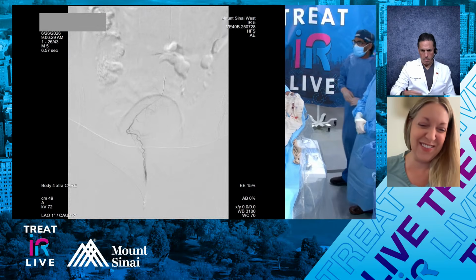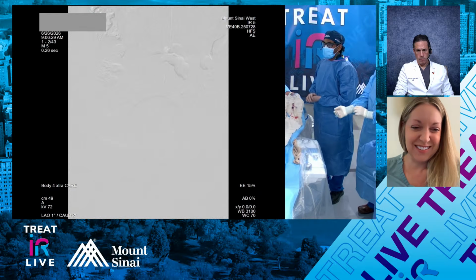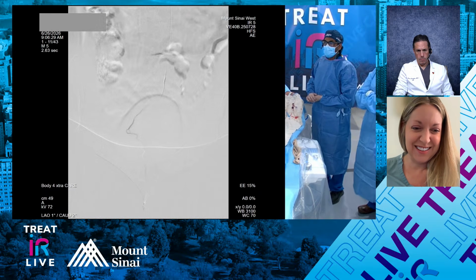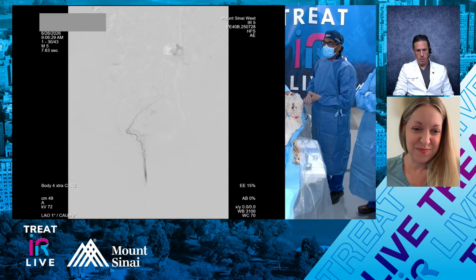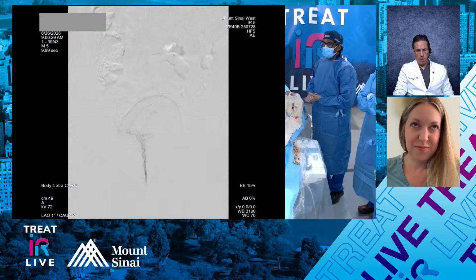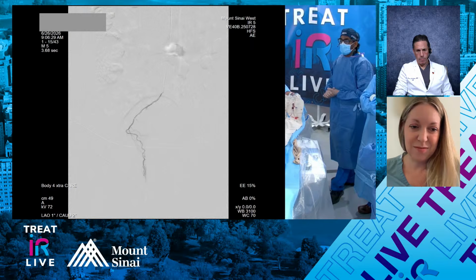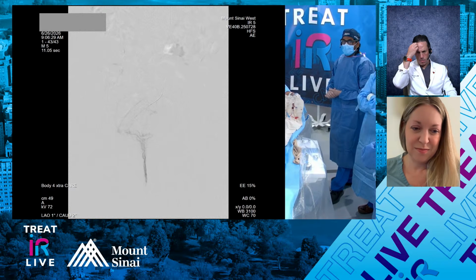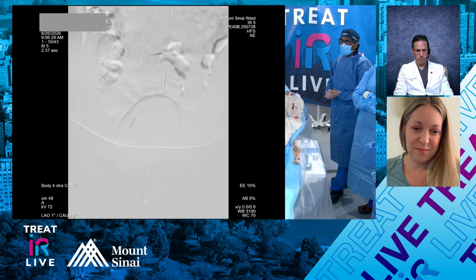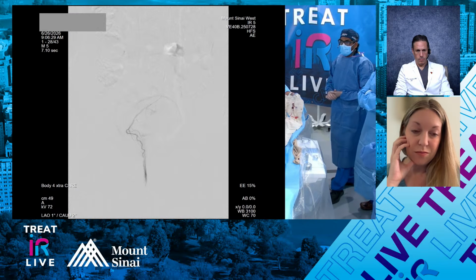Thanks. So just to be clear, I did an IMA run, which we'll try to show at some point. We're just having a little technical issue. And then I selected a right-sided superior rectal artery, and I think it's a very good demonstration of the pathology that we're trying to treat here with the corpus cavernosum recti. You can see the draining veins, consistent with the underlying pathology, this being more in the AVM range than a true parenchymal staining pattern.